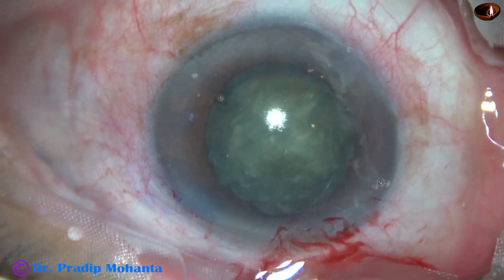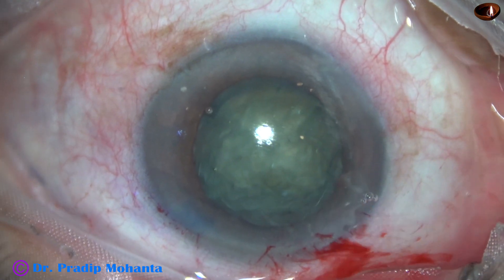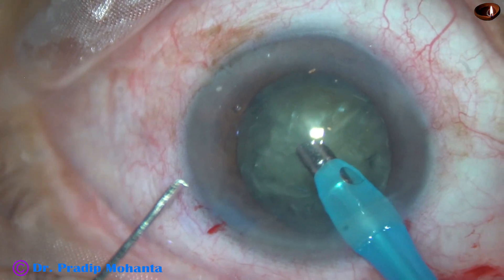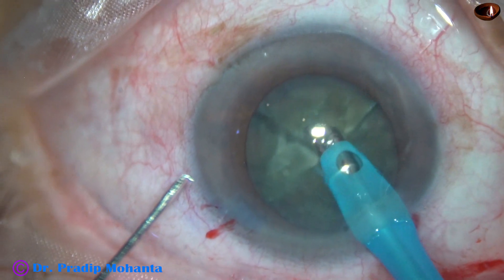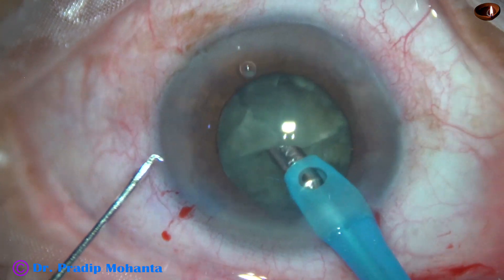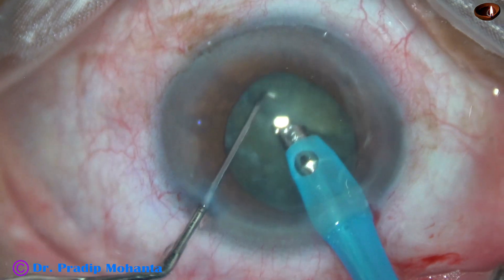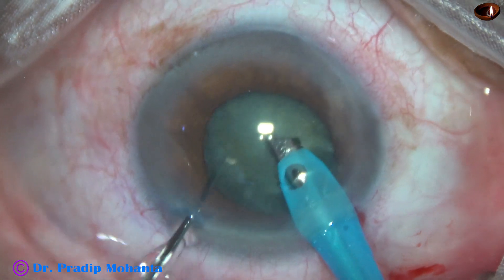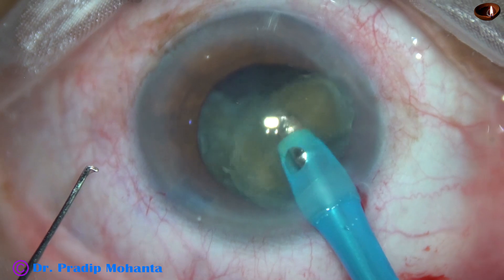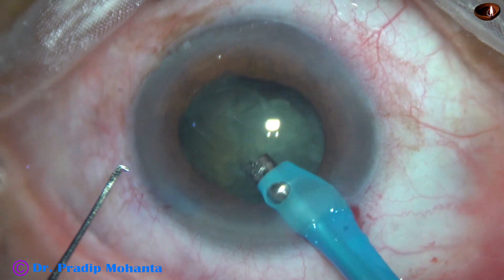My plan is to use the chopper as minimally as possible. Because in such cases, when there is IFIS, the iris tends to come into the side ports, and if we use the chopper we cause iris stromal shaving. However, I could not get free fragments and had to go in with the pre-chopper. So what I do is divide and come out, then emulsify the piece with the phaco probe itself — and I could do that.